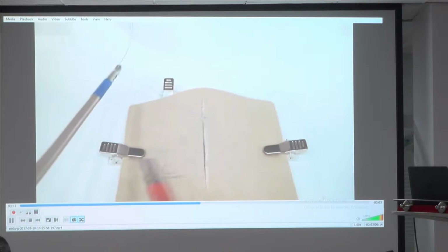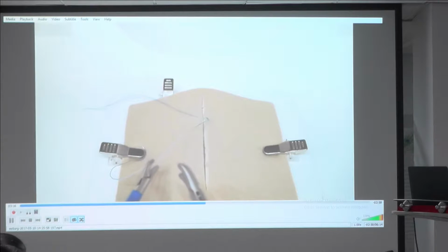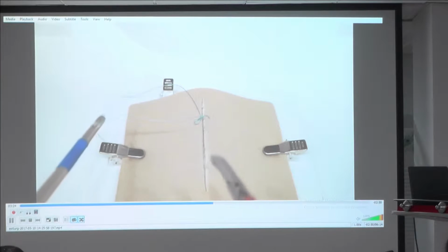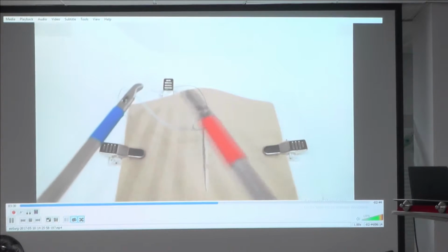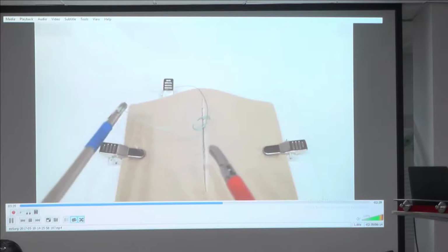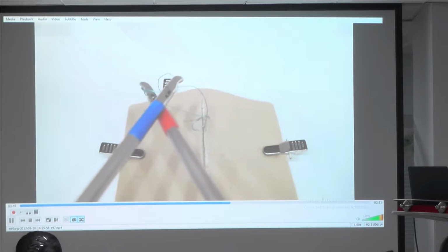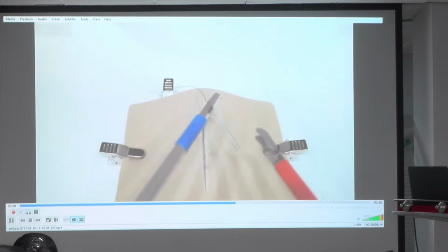It means that you lose a lot of suture. At the end, an effective part of the suture is wasted by too long a tail, and the tail comes always in and out. I'll tell you, that is someone who pretended to be a colorectal surgeon doing advanced procedures, doing bariatric surgery in Saudi. So I don't think I would like to undergo bariatric surgery by him.